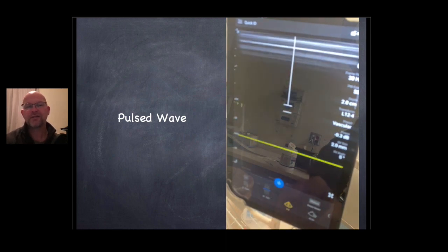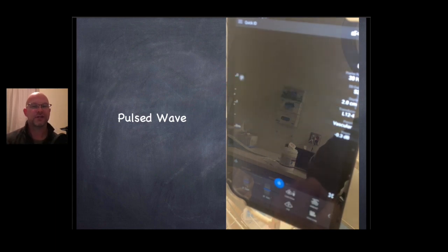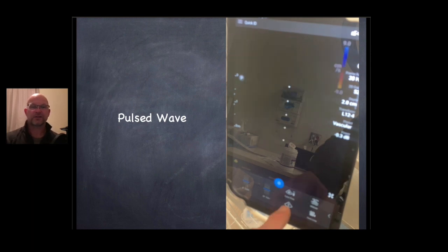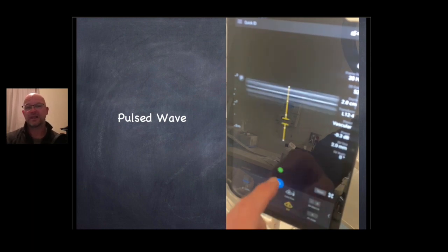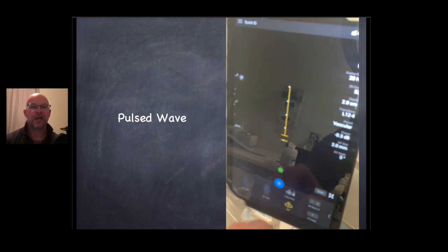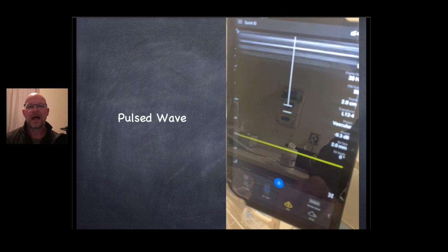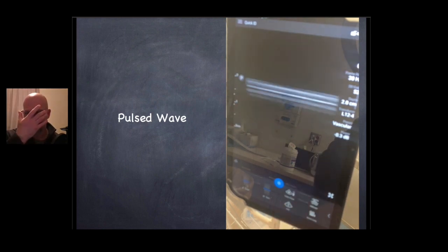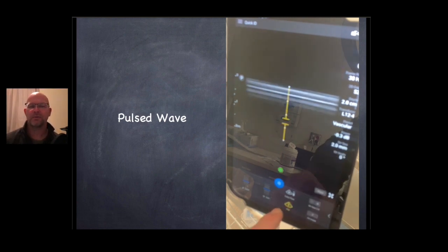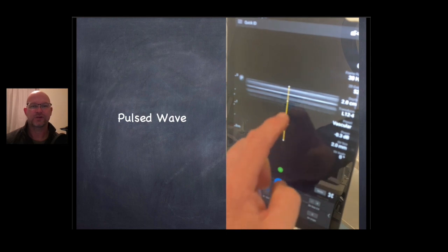All right. That's kind of an introduction to ultrasound IV. I hope that was helpful. The more you train and the more you use this, the better off you're going to be. If you actually take this the first time and just find the vessels and then lay it down and do a normal IV, you're one step closer to becoming more comfortable with this. I don't understand why certain places will take it away. One place took it away because there were infiltrations. Well, how many blind stick IVs infiltrate as well?